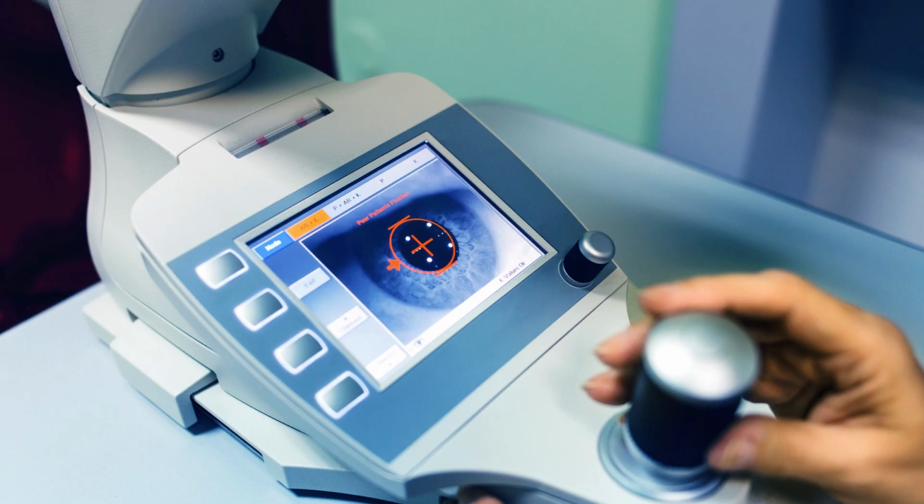Individuals with rapid change of spectacle prescription or rapid increase of diopter value, which can be a sign of keratoconus. Prospective cataract surgery patients: topography helps quantify corneal astigmatism, cylinder, and axis, and identify patients with corneal abnormalities that preclude multifocal IOLs.